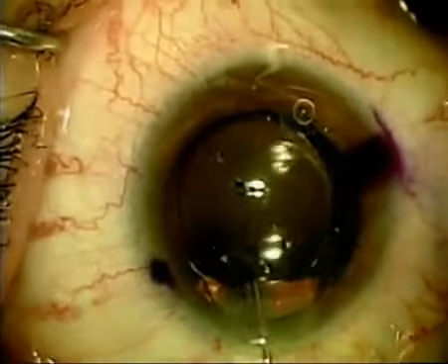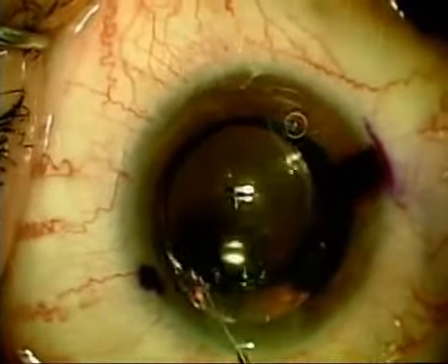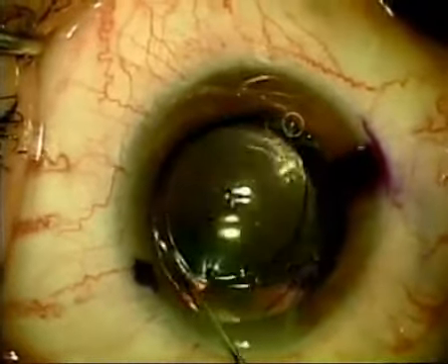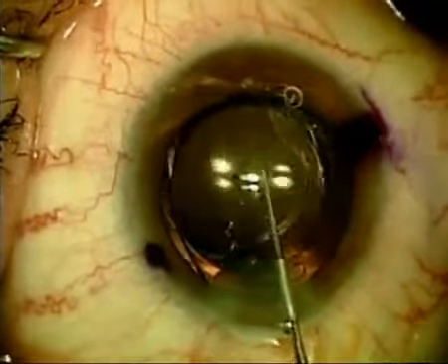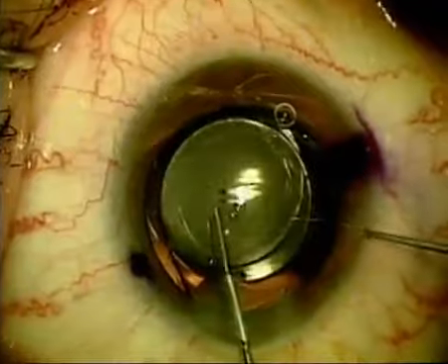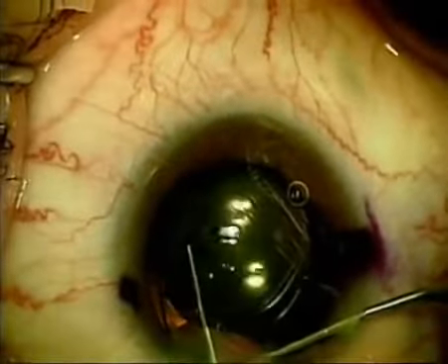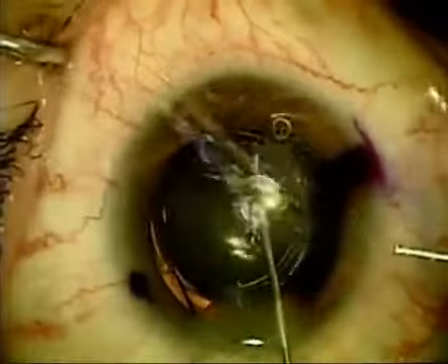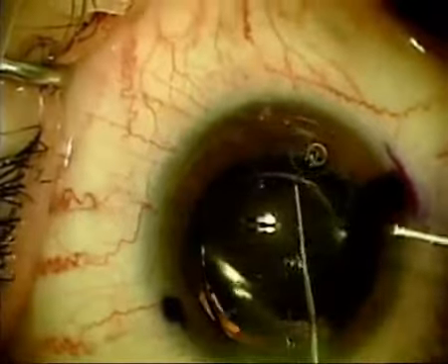This is an implantation of the Sulcoflex pseudophakic supplementary toric IOL for the correction of residual corneal astigmatism. Note that the pen marks on the eye represent the axis of highest corneal power. The IOL axis of lowest power is indicated by two diametrically opposed marks on the optic periphery. The IOL axis of lowest power is intraoperatively aligned with the corneal axis of highest power. Note the ease with which the lens is rotated into position.